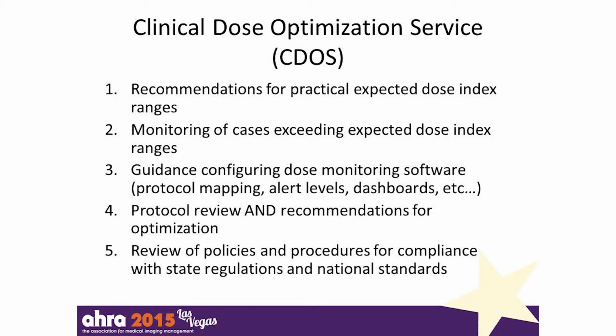What are you going to do once one of those comes in? How do you look at them? What benchmarks are you comparing them to? Third is guidance on configuring dose monitoring software. Issues like protocol mapping, setting dose alert levels, creating dashboards, generating reports, things like that.